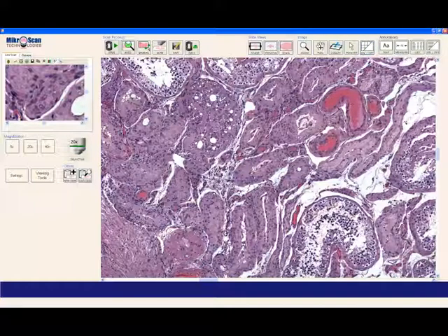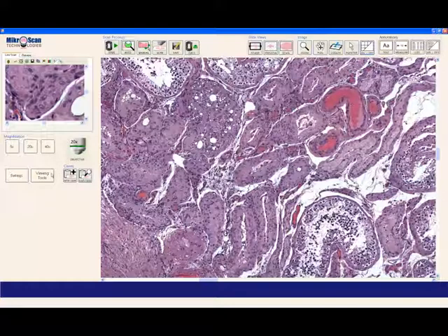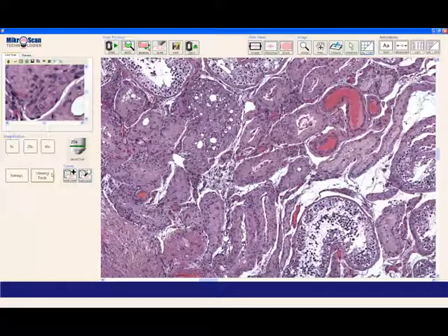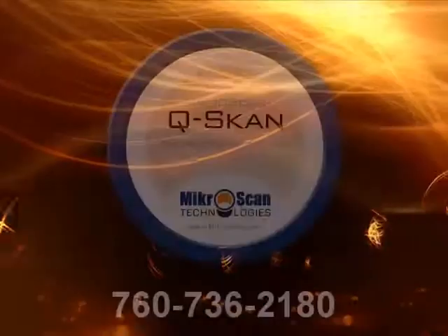We're glad to have given you the opportunity to see some of the viewing tools on the Microscan slide scanner. Why not give Microscan a call and see just how affordable your digital pathology solution can be?